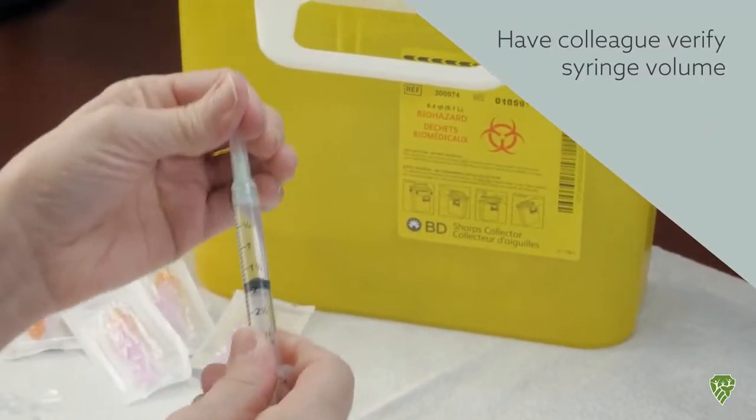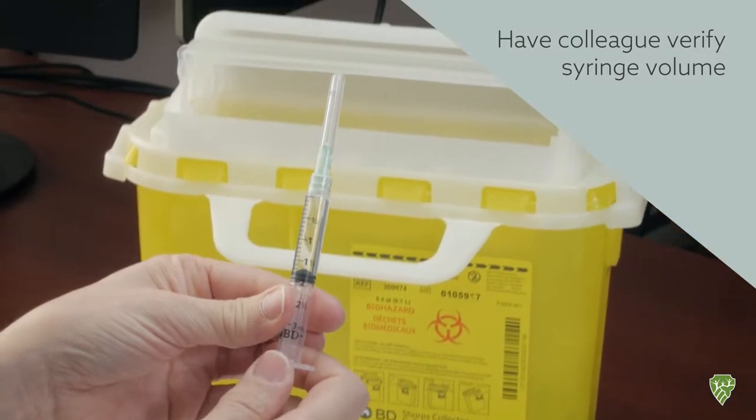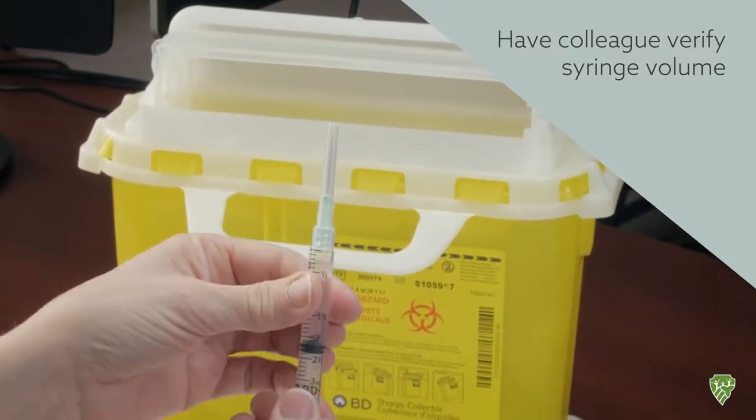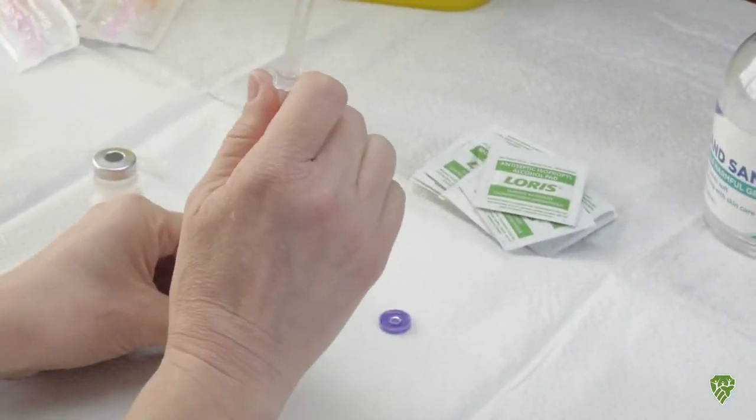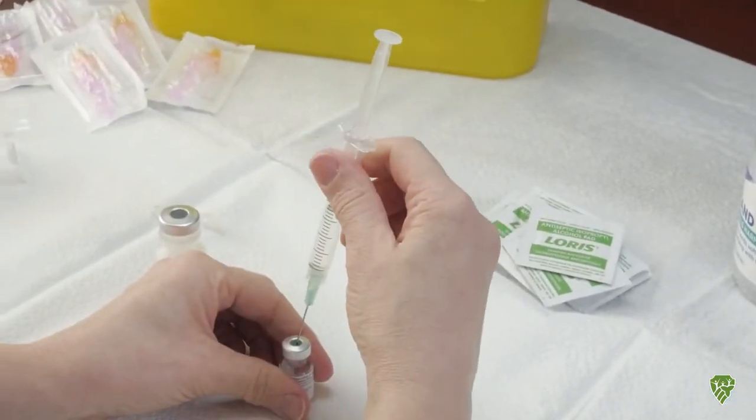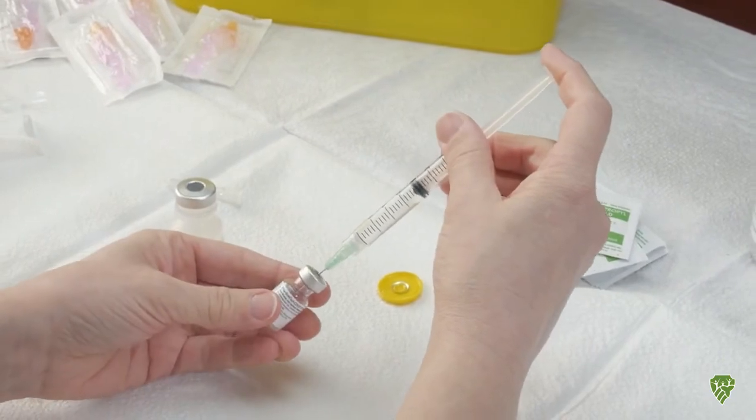Good idea to have someone else check the volume, and then pull back to get a little bit of air into the syringe. And now I'm going to inject this, just very gently.